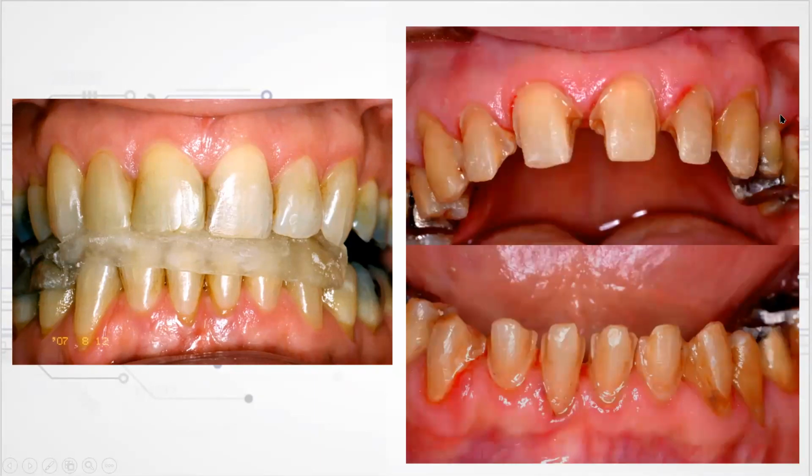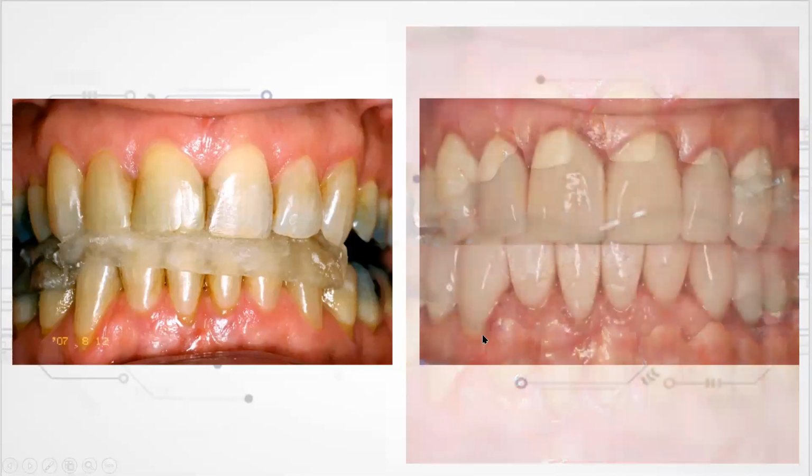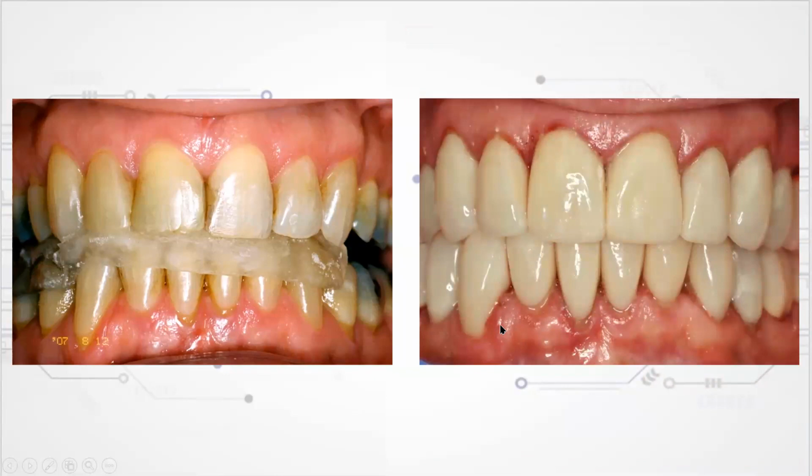We make veneer preps because there's no need to full cover this case. And then we install these ceramic veneers, full coverage crowns in the back, adhesive dentistry. And this is the day of delivery. And you see the case looks fairly well interdigitated.